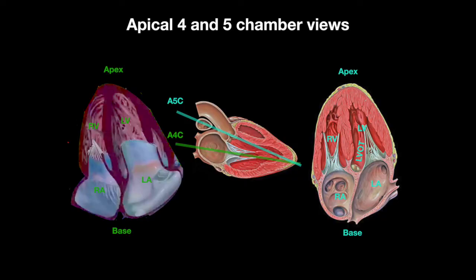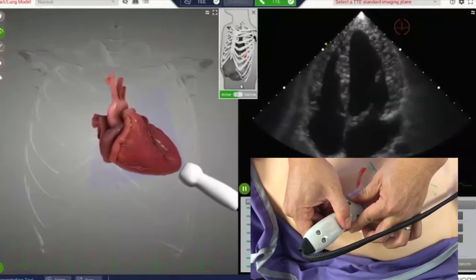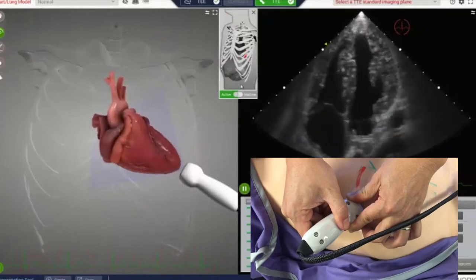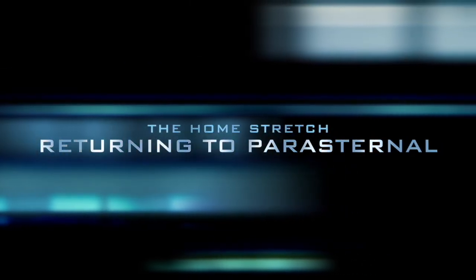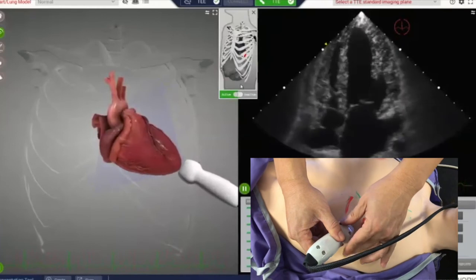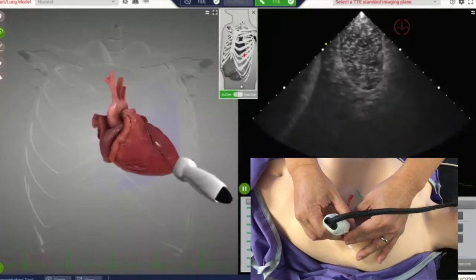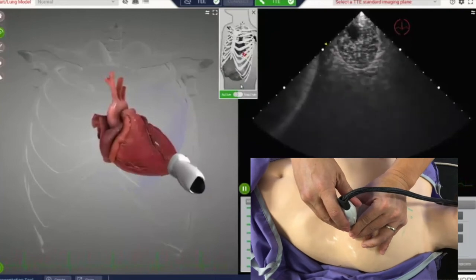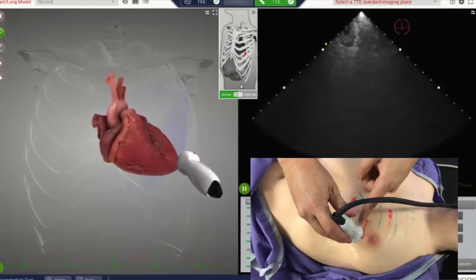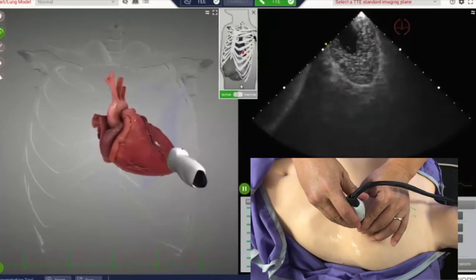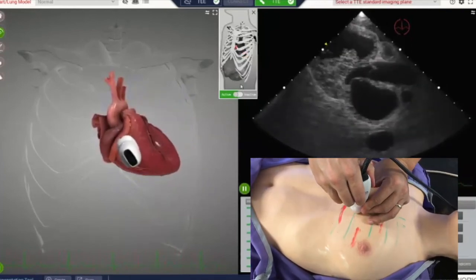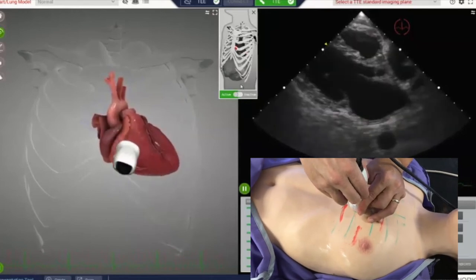The apical five-chamber is obtained by starting at the four-chamber and slightly tilting the probe anteriorly to obtain those four chambers plus the left ventricular outflow tract, which is the fifth chamber. You only need to tilt about one or two degrees to get the five-chamber. To wrap up, return to the parasternal short axis: tilt towards the apex, then slide from apex to base using the long axis as a guide, and rotate back to the parasternal long axis window.